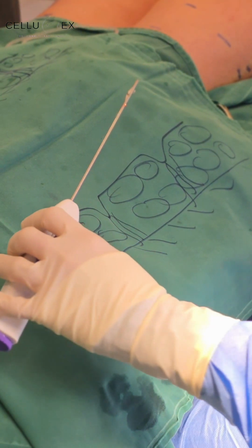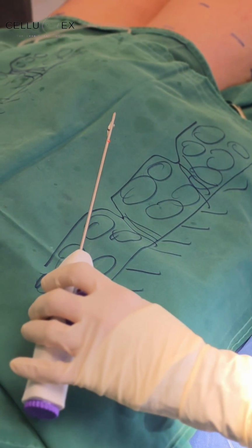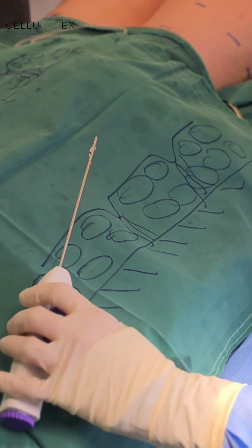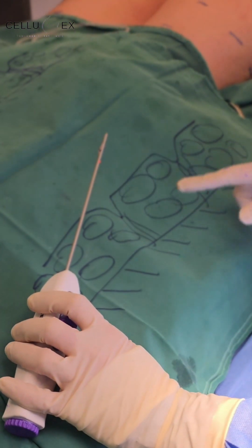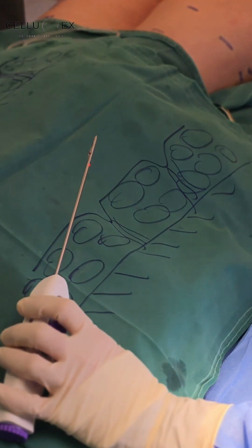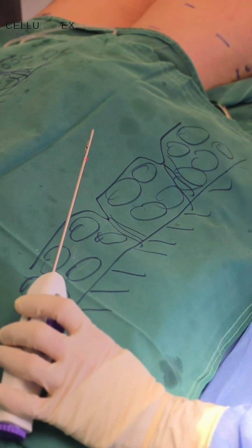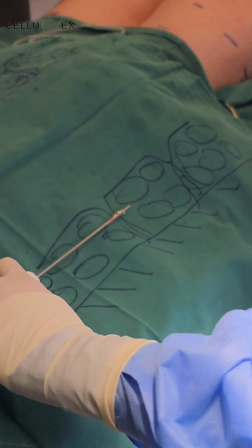We use a single entry point that allows access to multiple dimples, the ones that we marked before, which minimizes trauma and scarring. The correct plane to go is the superficial subcutaneous tissue just beneath the dermis. Too superficial would increase the risk of contour irregularities, and if you go too deep, the septum will not be released properly. So, for example, this is our incision point.